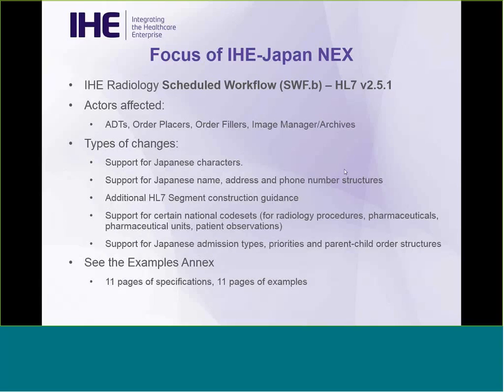And because Japan was able essentially to leapfrog a little bit, while the US primarily focused on HL7 2.3.1, Japan got in a little later and they stabilized on 2.5.1, which is arguably a little better, a little more complete. And so when we made those changes to Scheduled Workflow.b, there were a few national requirements that are addressed here. In terms of who needs to pay attention to this, if you're an ADT, an order placer, an order filler, an image manager, this is all about the HL7 transactions. If you're a modality, you're lucky, you get off mostly free.